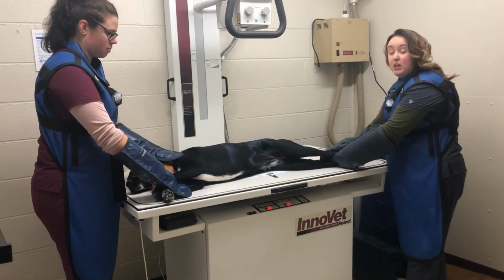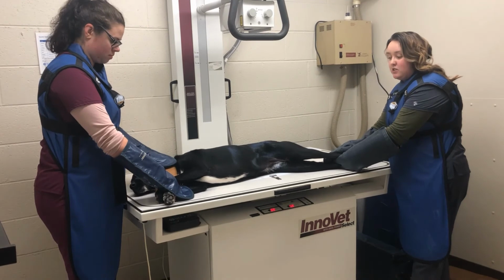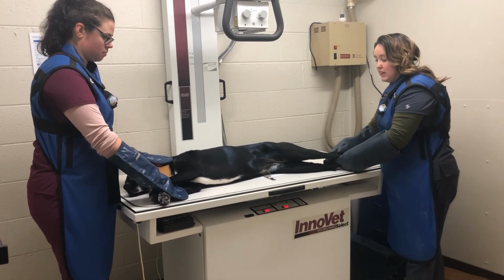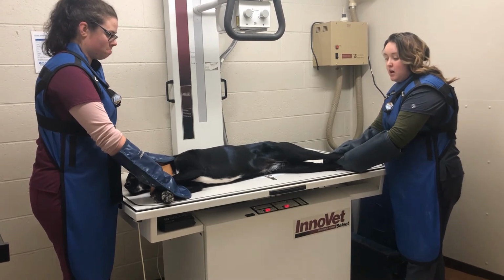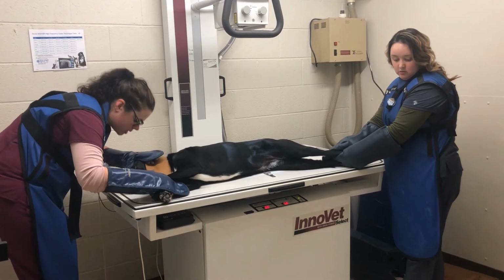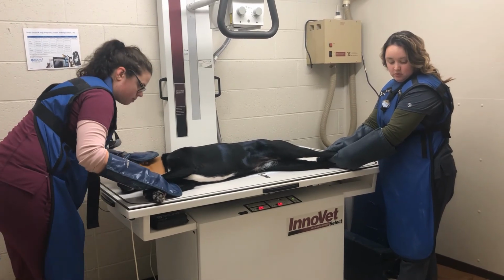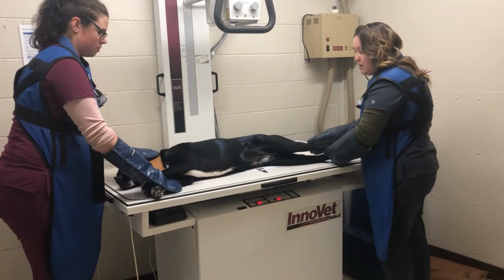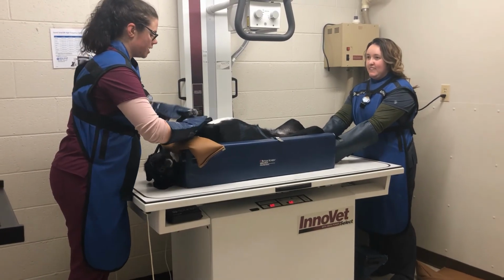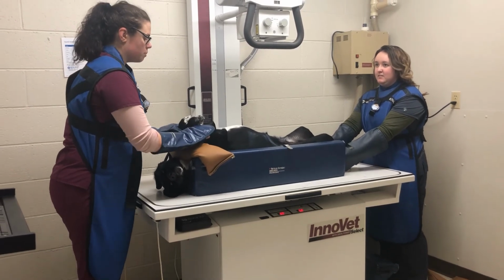We are taking Willow's minute 0 radiograph. We have her in right lateral, so we can get a picture of her abdomen. So we'll just take that image. Excellent job, Willow.